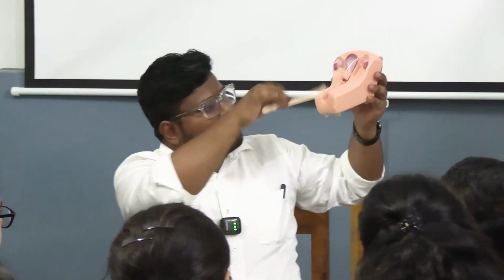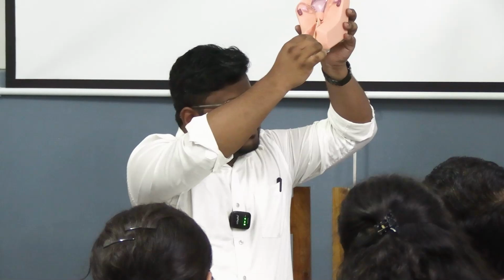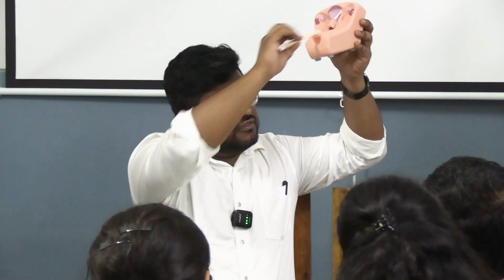Any question on this? কোড দেখাতে হবে, হ্যাঁ জিনিসটা কিন্তু করে দেখাতে হবে। You will get a model. এখানে অ্যাট প্রেজেন্ট তো সার্ভিক্সের মডেল সেরকম দেখছি না, ধর আমি এখানেই দেখাচ্ছি ফর এক্সাম্পল। একটা স্পেকুলাম লাগানো আছে। Imagine a speculum here, I am putting it right here into it. External os এ আমার পয়েন্টি এন্ডটা গেল, ঠিক আছে, scraping it, 2 rotations of 360 degrees, আবার কোথাও টাচ না করে বের করে নিয়ে আসবে। Smear, keep it aside.